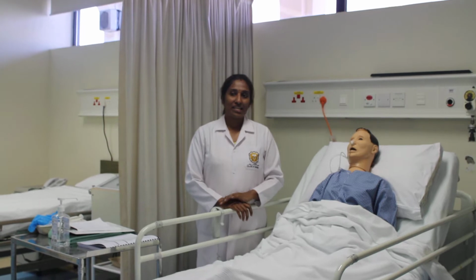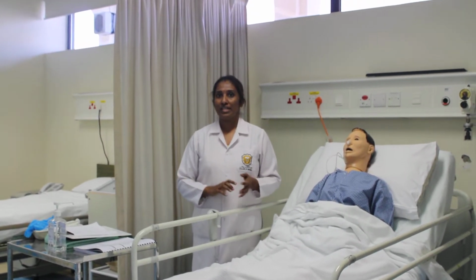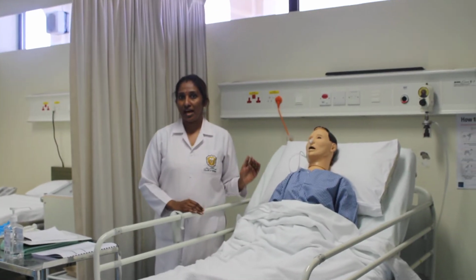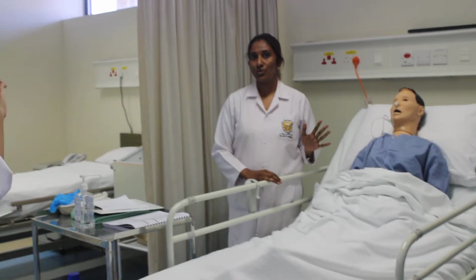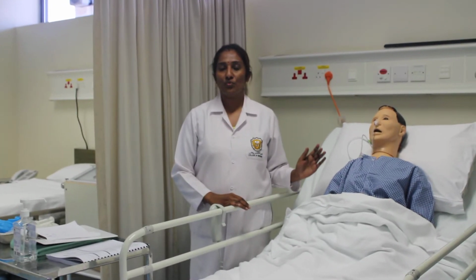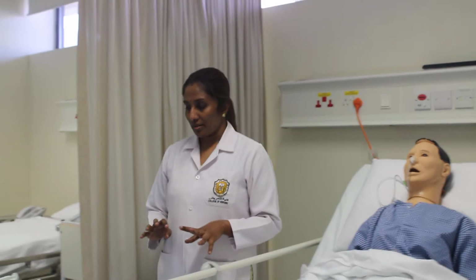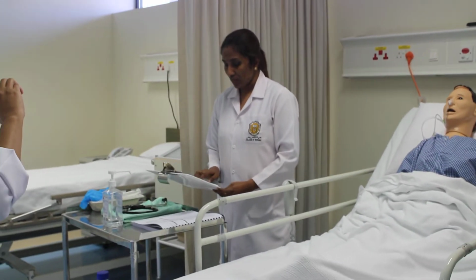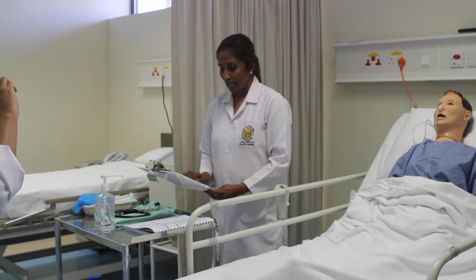So now let's see the procedure of NG tube removal. We have already seen the NG tube insertion and NG tube feeding. Now the third aspect of that procedure is NG tube removal. Once the patient is ready to eat by themselves, then you will proceed for removal of the NG tube following a physician order. So let's check what is the procedure written for this patient. The physician has advised for removal of the NG tube and normal diet.